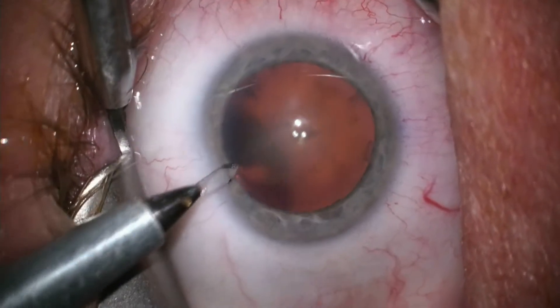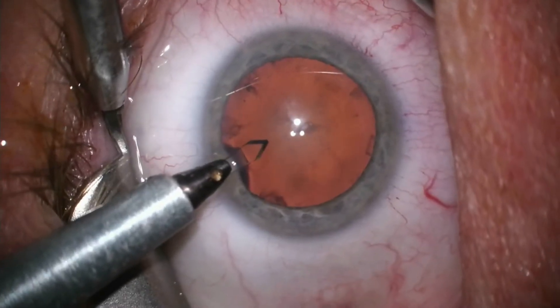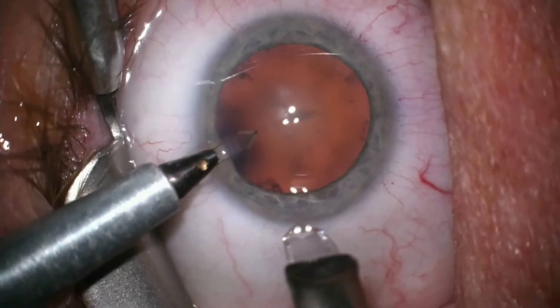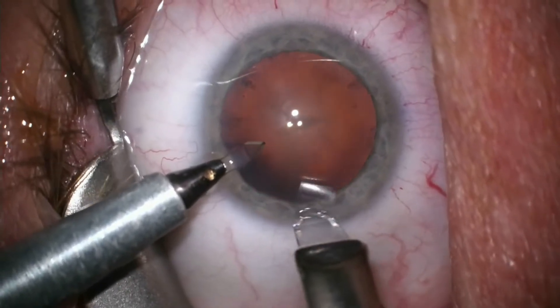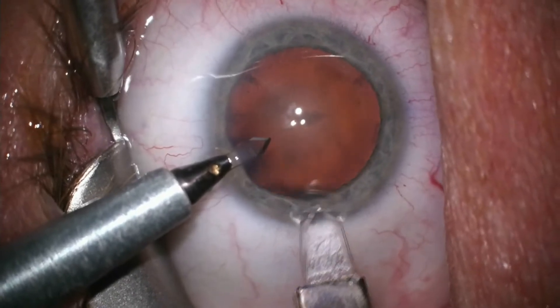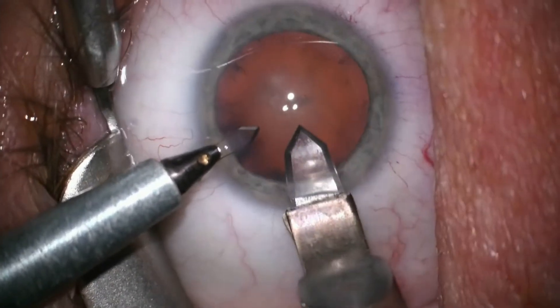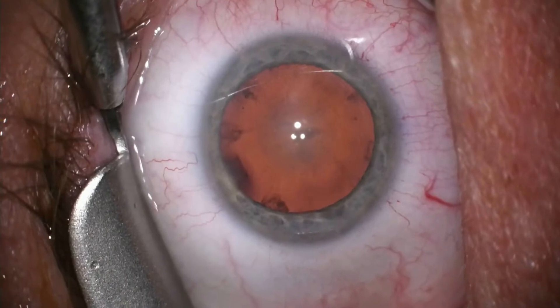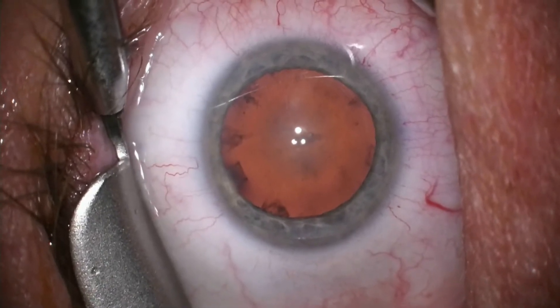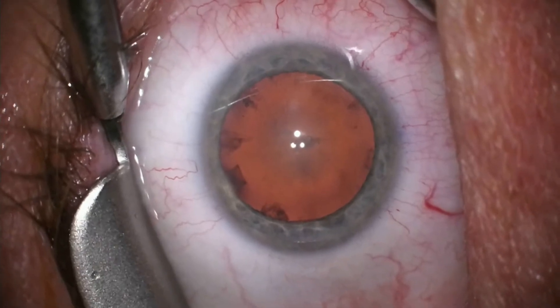To begin the procedure, two small openings are made through the clear dome of the cornea, and now I am making a stepped primary incision into the eye. I like to tailor this incision to be self-sealing so patients can resume their normal activities almost immediately after the procedure.